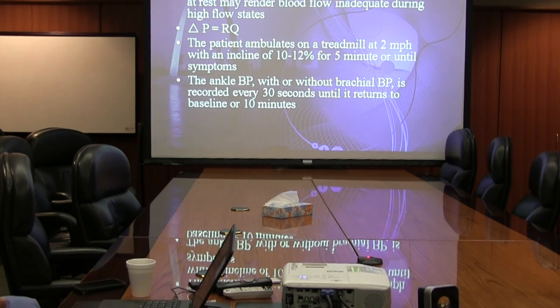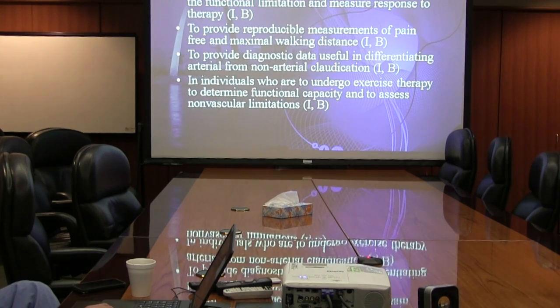Now, we used to have a protocol, and it's kind of fallen off, that the vascular techs would understand that if your rest ABIs were abnormal, they didn't need to go on and get exercise ABIs. If you've got a gradient at rest, you're going to have a gradient at exercise. But still, if you order them, you'll see you get both, even though the rest ABIs are 0.7 there. Does that make sense? I think that's most important.